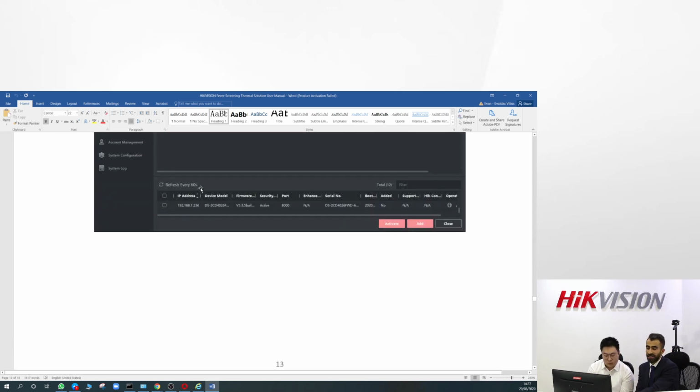actually I will just look at the dashboard and take some questions if it's possible to answer them here. A good question here about the car. The camera scenario should be indoor first of all, not outdoor. The car would be outdoor. It's not recommended to detect the person from inside the car, because the glass will also affect the temperature.